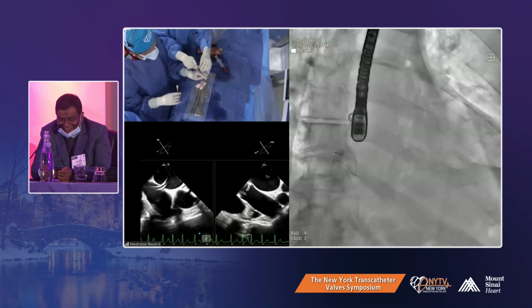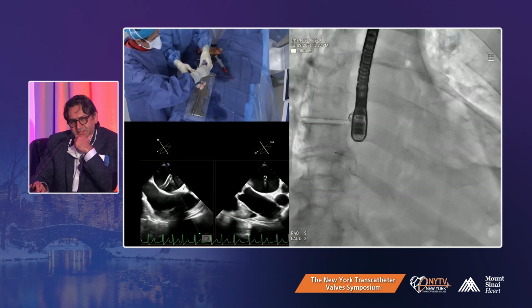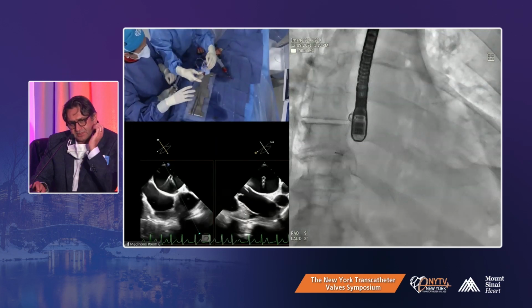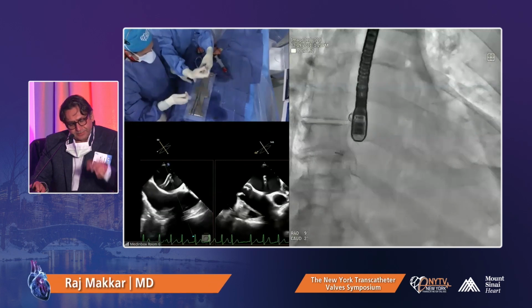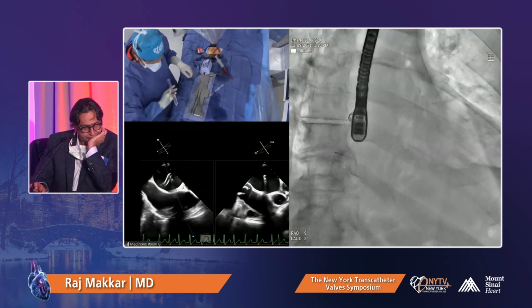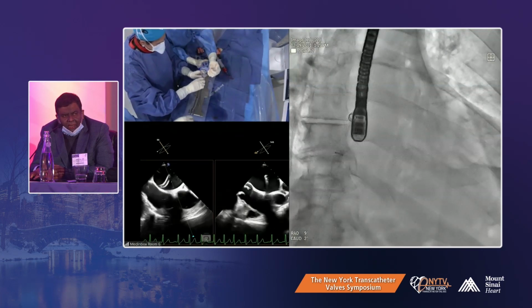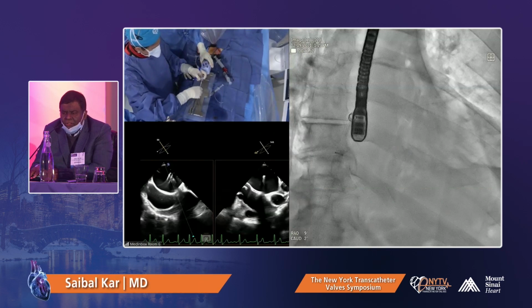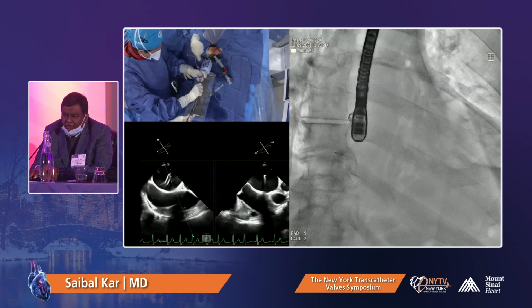So I think a little bit about XT versus NT, right? We were very gung-ho on XT when it first came out for functional MR, and then we noticed some tears because it grabs the leaflet, but predisposes a little bit to tear. So we backed off and we started doing NTWs in functional MR. But we are using XT here, right? Any reason? I analyzed the EXPAND data for leaflet injury, and it was actually not that bad. It was not very controversial. So I think it's reasonable.